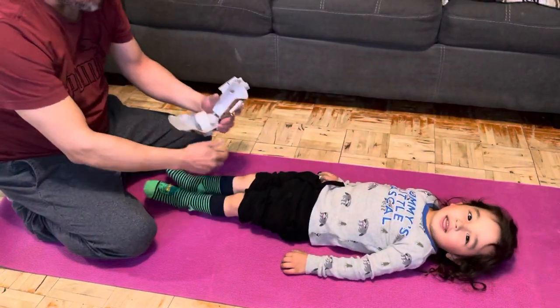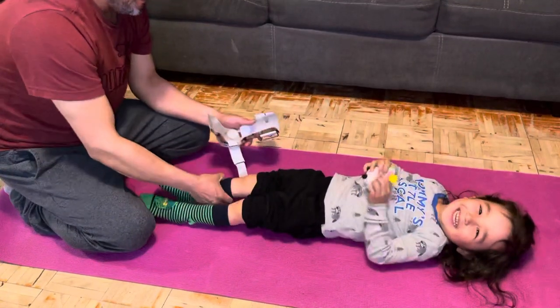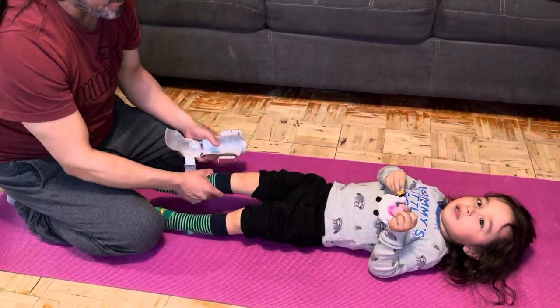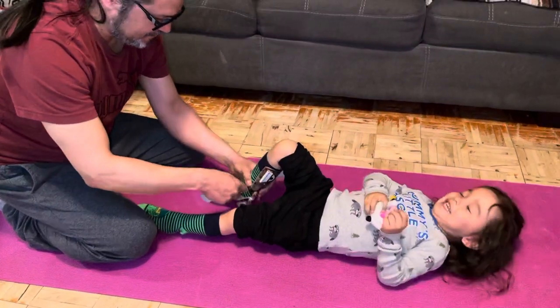This is Ryan's AFOs — hopefully he'll cooperate. You can either do this sitting down; we usually do it with him lying down because his legs are short, so it's easier.